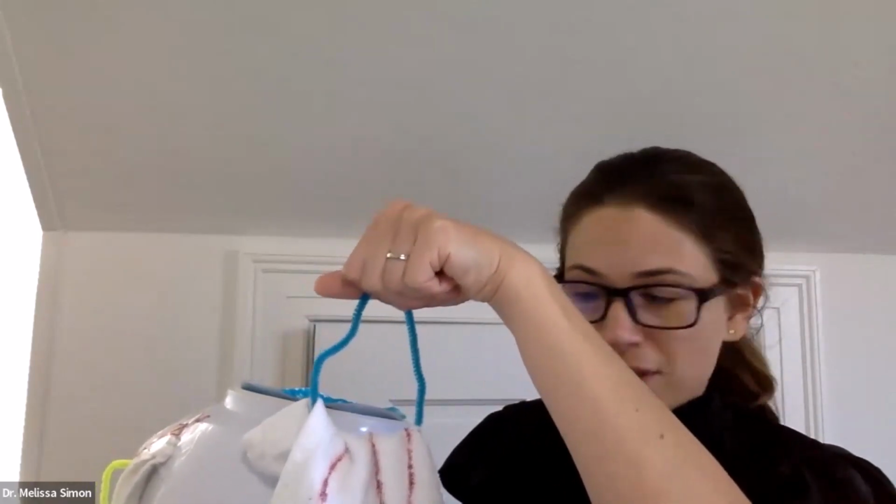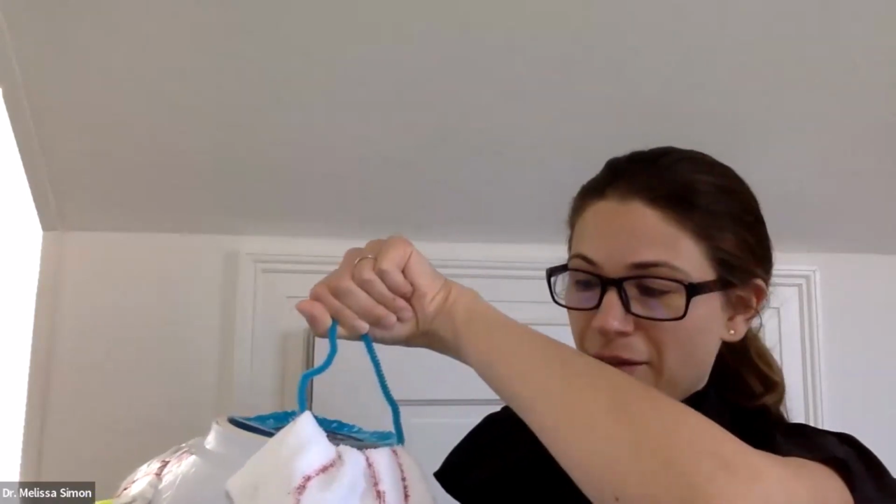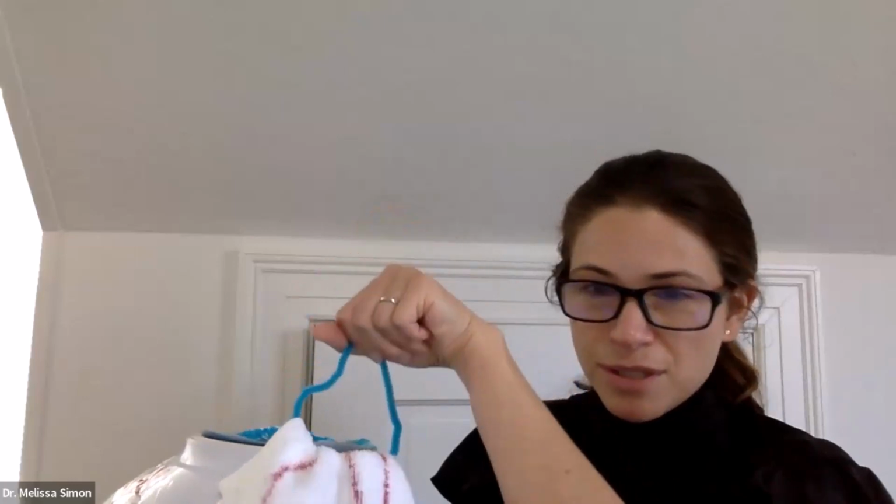But for plication, you do have to gently pull up away from the eye towards the ceiling. Then you pull towards the limbus, parallel, much like you're used to. Normally, when you recess or resect a muscle, you're pulling in the plane towards the limbus. But for plication, it's up, then towards the limbus, up towards the limbus, once or twice, sometimes even 3 times, depending on how much the muscle is willing to move to get it to lay flat. And then you finish laying your knots.